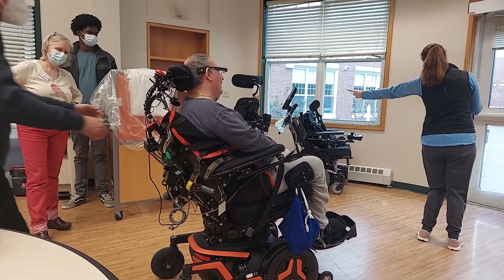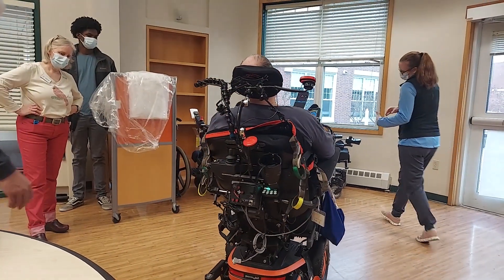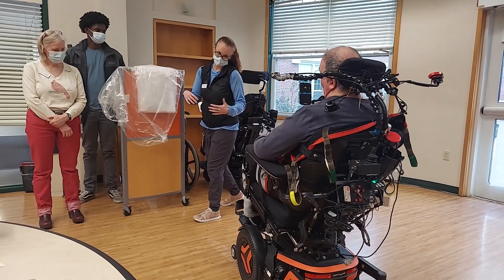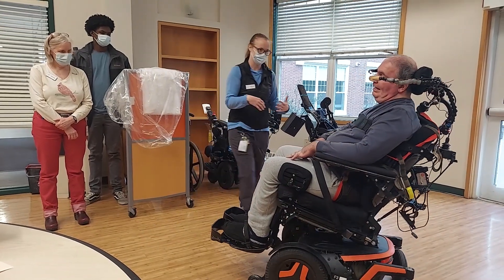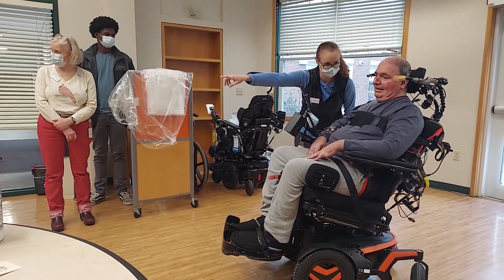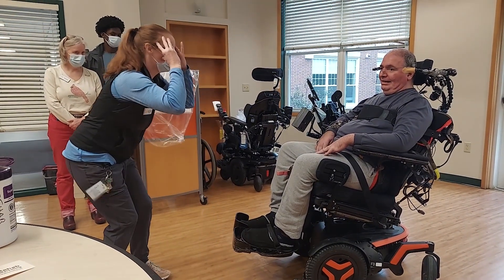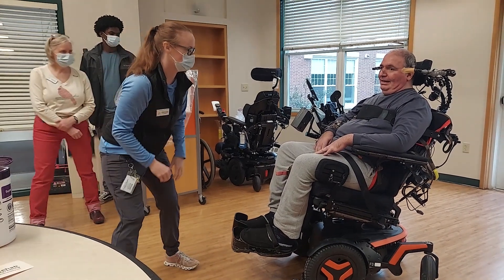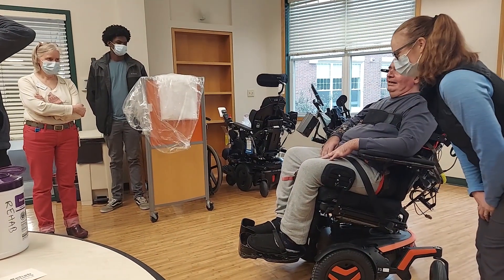Turn around, there we go, that's it, nice. Now go towards one — stop — there you go. That's it. As soon as you bring your head back to a neutral position, okay, so now how do we go forward? Yes, there you go.